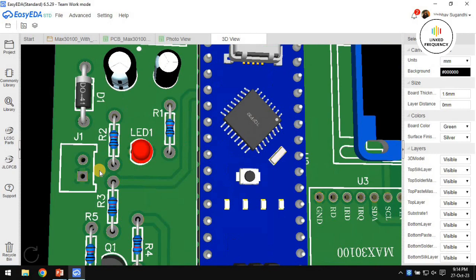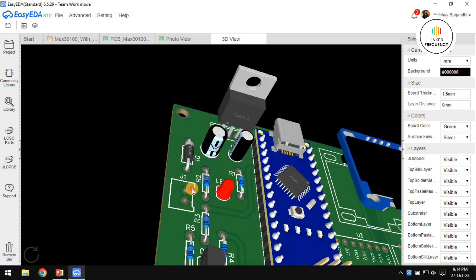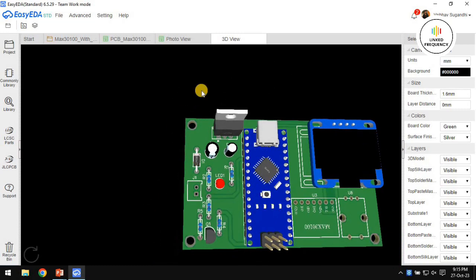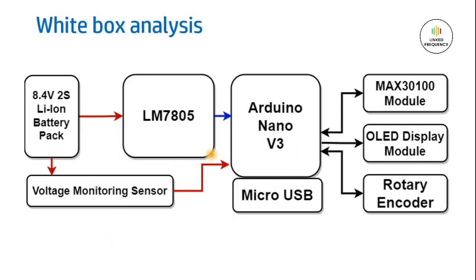And this is how the RMC connector looks. Here the 3D model is not loaded. We have not uploaded the 3D model, but you can see that it has a one-side connection, so it goes in only one direction. So this is how we need to understand and design the MAX30100 sensor interfacing with the Arduino Nano development board. This is all about this particular project.